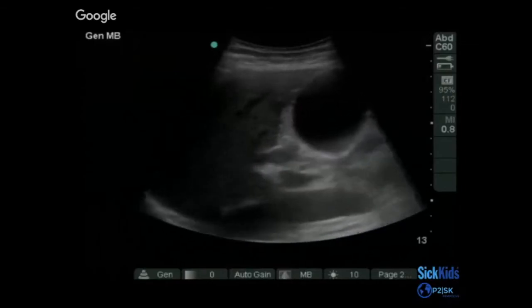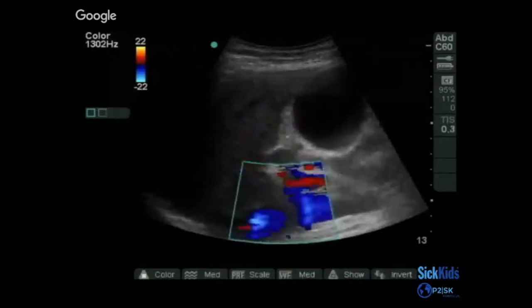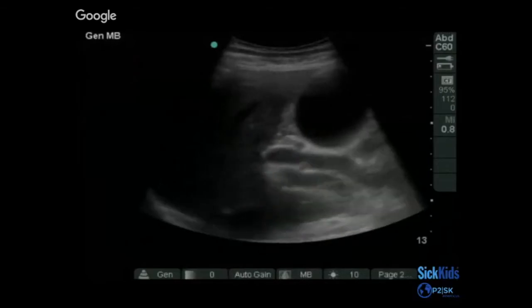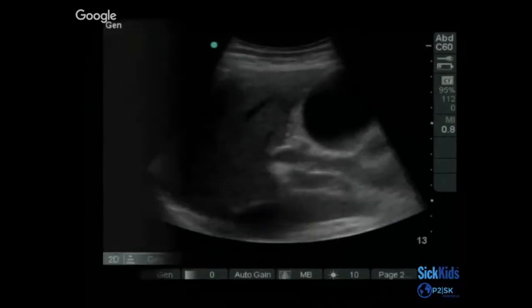Some people use different values as you grow. I think there are some metrics where if you're under a certain age, it can be less than 4 millimeters, but most of the time we think about less than 6 millimeters as being kind of normal. Once you get above 6, especially above 10 millimeters, then it's definitely abnormal.